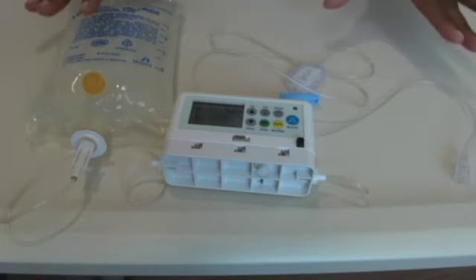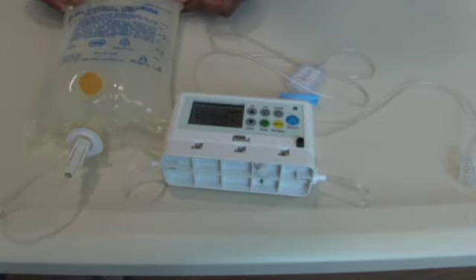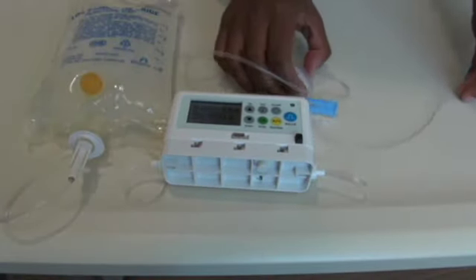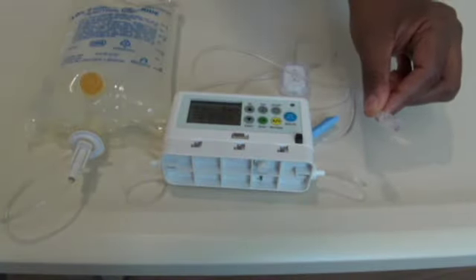Here is the pump all set up — the nurses would have done this already. The local anaesthetic solution, sodium chloride for the purposes of this video, is inserted through a cassette. The giving set has a stop valve on one side and connects to the patient's catheter.